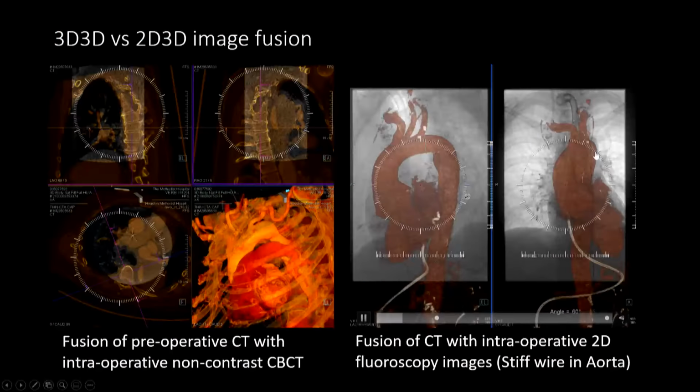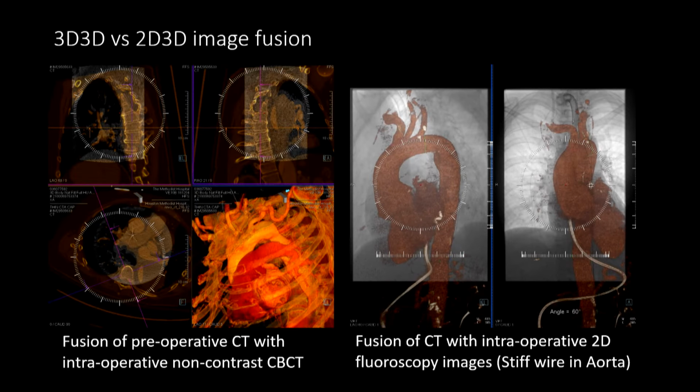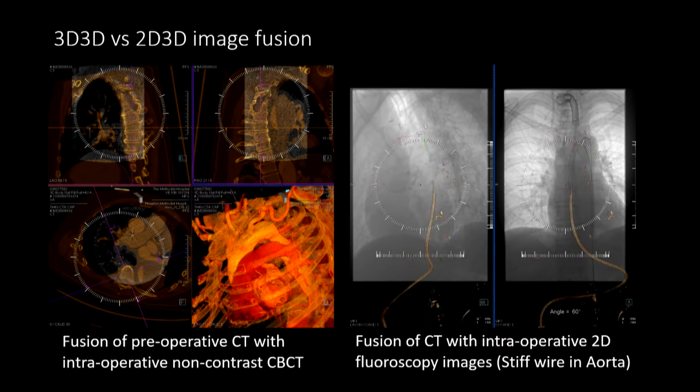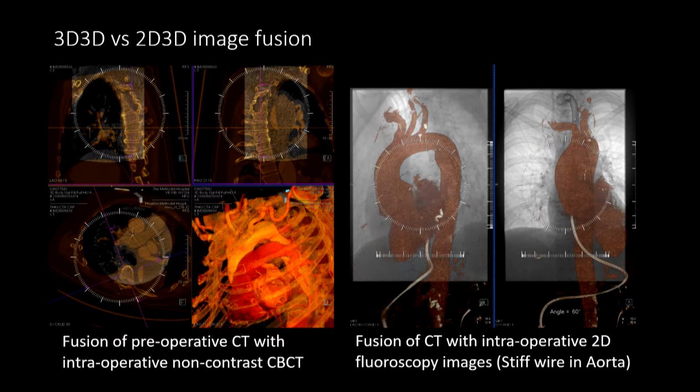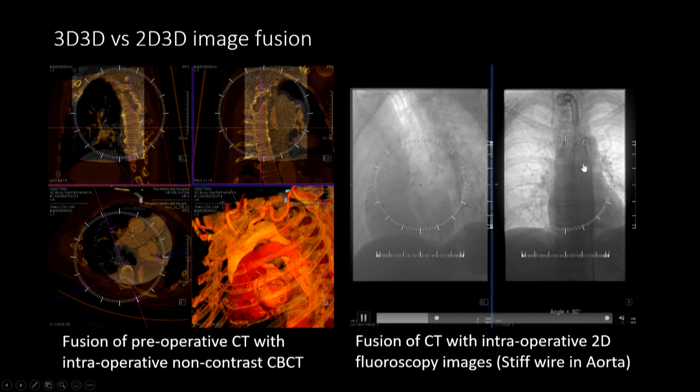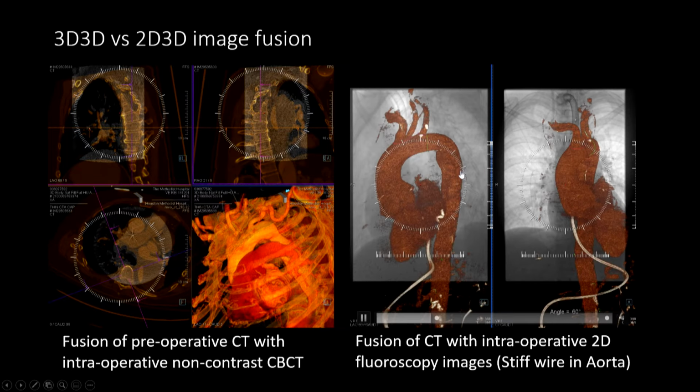And because we are doing vascular registration, we are not matching the spine, because the patient's arm position can be different with CT, because in CT the arms are always up, but in the OR the arm position can vary. So we are deriving our own aortic fiducial by putting in wires and doing the registration.